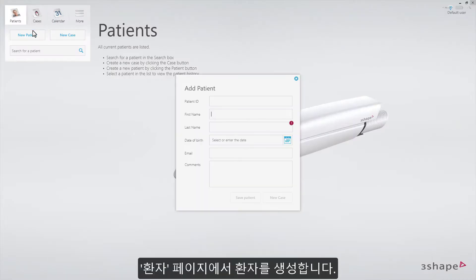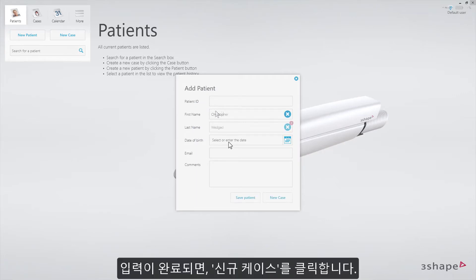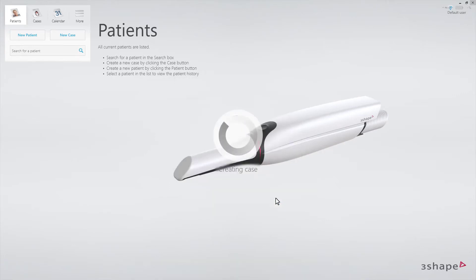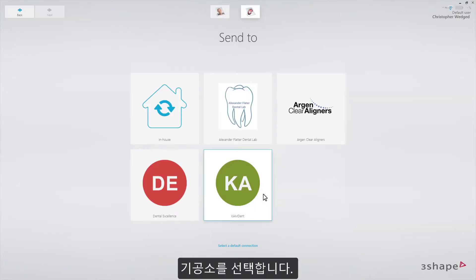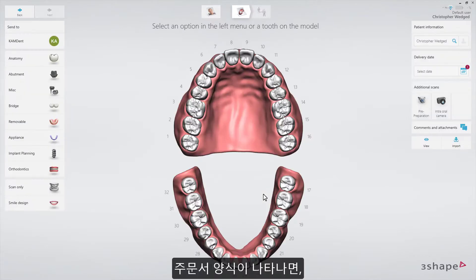Starting on the patient's page, create the patient. Then select New Case, select a lab, and the order form will appear.